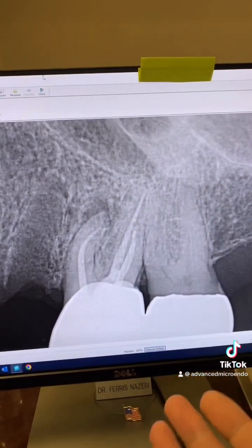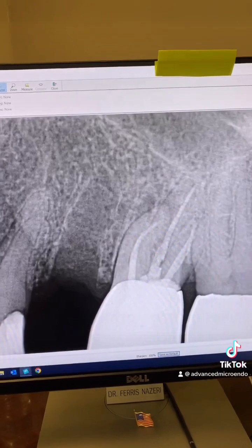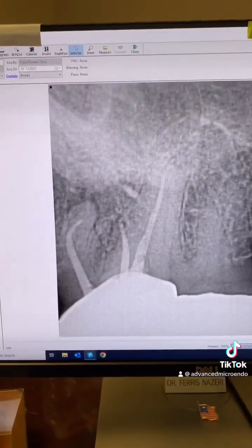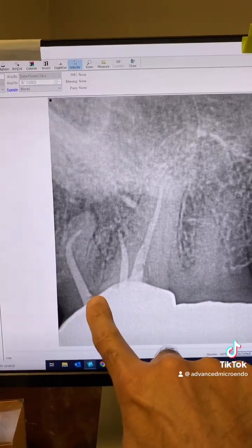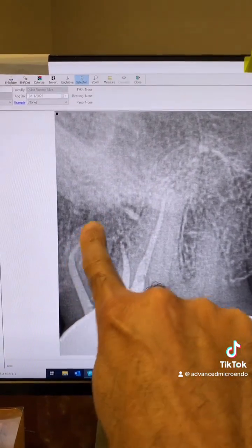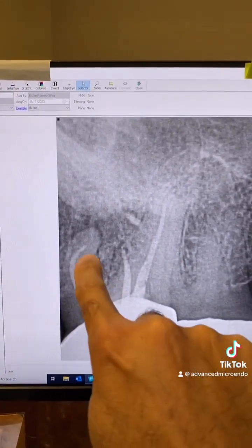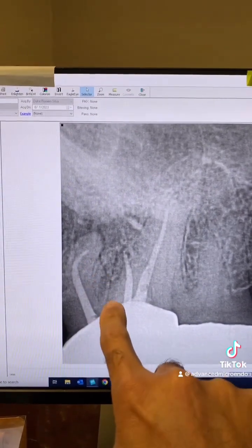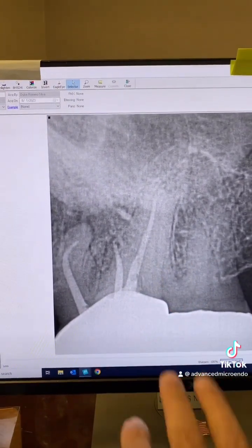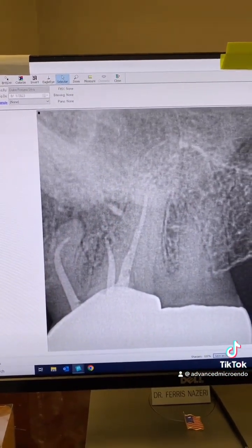This is why it's important to take multiple angulation PAs. Look at this angulation — you not only see the 90-degree curvature of the canal here and peripheral lucency, but you also very likely are looking at a missed MB2. Taking multiple angulation PAs gives you a better understanding of the anatomy of the tooth.